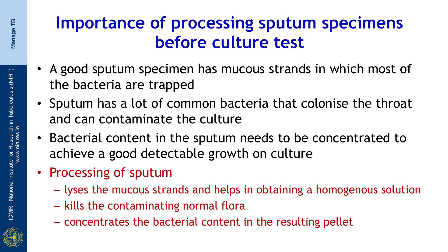Processing of sputum lyses the mucus strands and helps in obtaining a homogeneous solution. It kills the contaminating normal flora and concentrates the bacterial content in the resulting pellet.